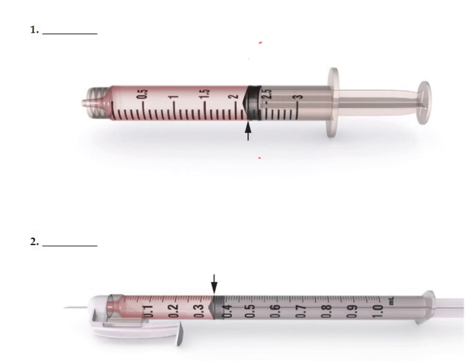And so you can see, what we're looking at is a 3 milliliter syringe. So keep in mind what we talked about, the distance between 1 and 2. There are 9 markings in between. These are the ones we count off in 1/10, so 0.1, 0.2 in between, and so on and so forth. So what that means is, between 1 and 1.5, those four markings in between are your 1.1, 1.2, 1.3, 1.4. That's why this is 1.5.